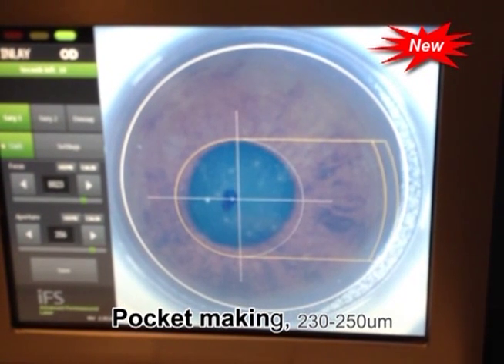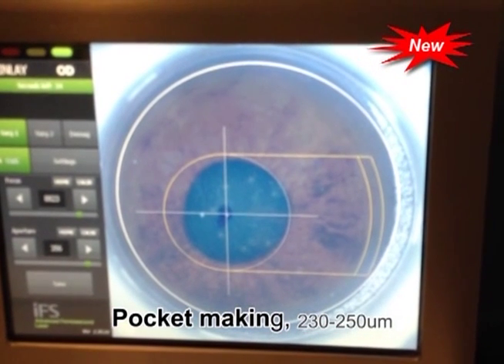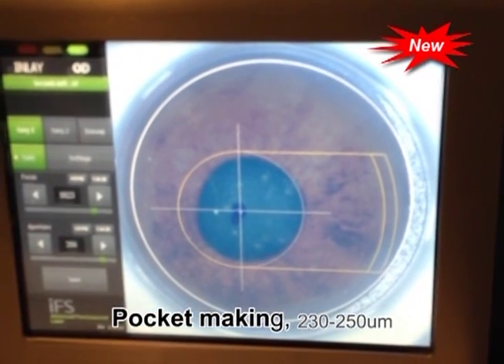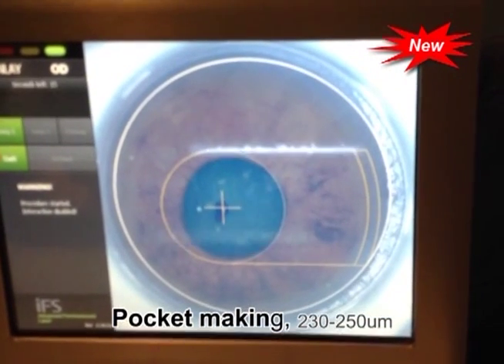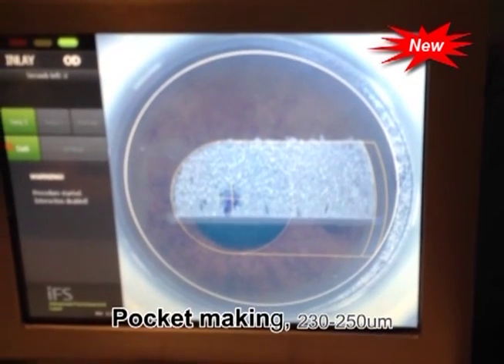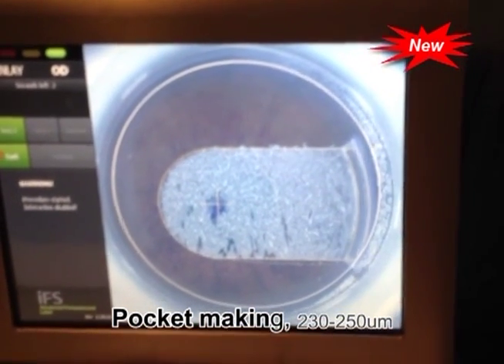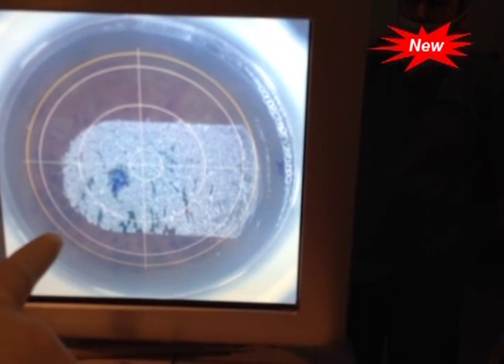Then we set the femtosecond laser machine to do a two-session treatment. The first session is a pocket centered around the marked area, between 230 to 250 microns depth from the epithelium, keeping at least 100 microns of stroma between the floor of the bed and the roof of the pocket. The second session creates a flap for correction of distant vision.